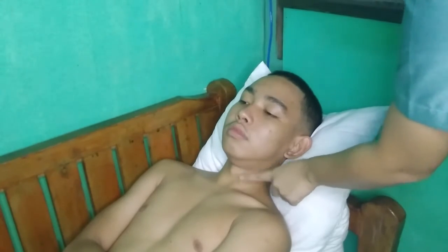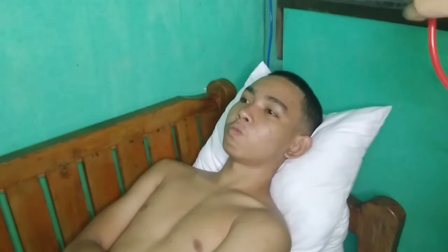The key whenever you're doing this is you want to press lightly with the stethoscope's bell to prevent hearing a false bruit or compromising circulation. And what you want to do is have the patient take a deep breath and have them exhale and hold it for a second while you're listening, so you're not hearing breath sounds and it won't mess with the sounds you're hearing.